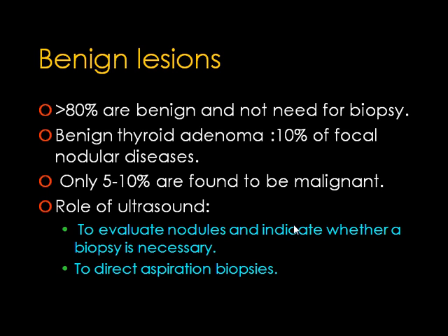More than 80% of nodular diseases are found to be benign and do not need biopsy. Benign thyroid adenoma comprise 10% of focal nodular disease, and only 5 to 10% are found to be malignant. So the role of ultrasound is to evaluate nodule and indicate whether biopsy is necessary. And the challenge is to reassure the majority of patients who have benign nodular disease and diagnose the minority malignant.